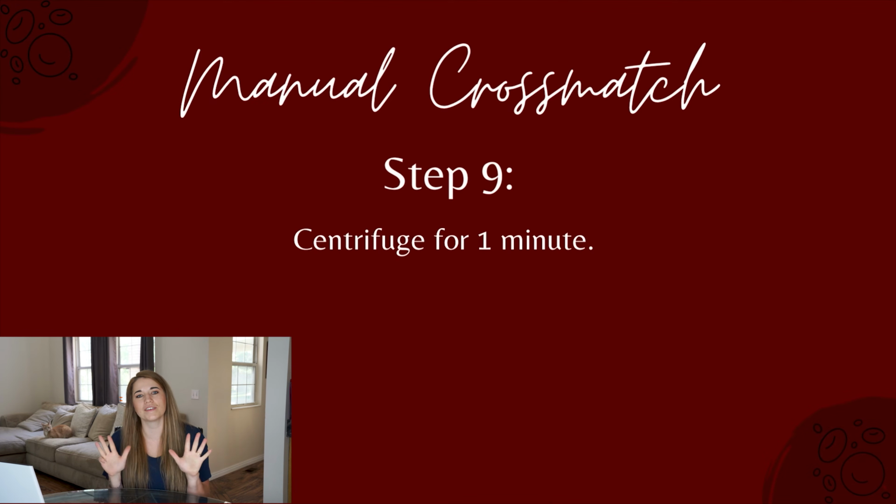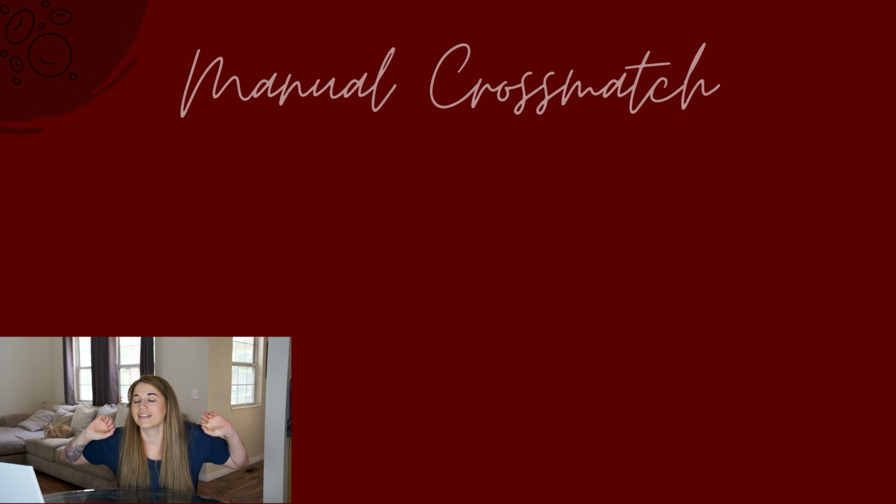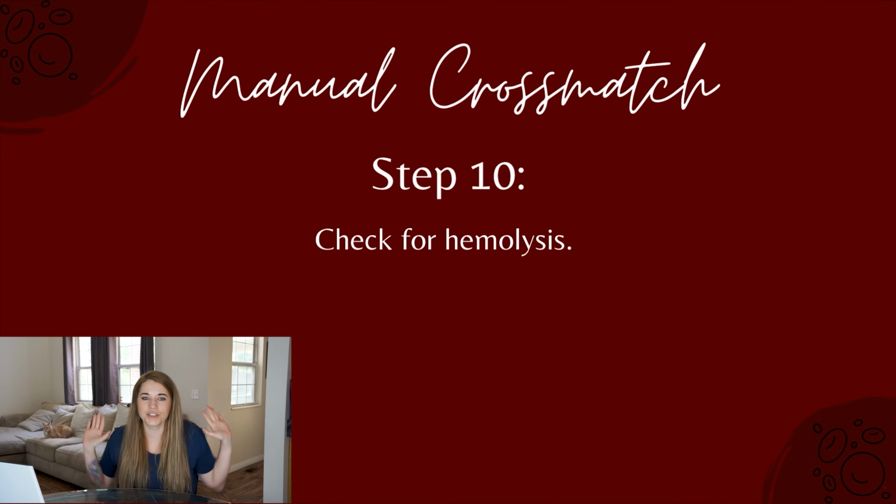Step 9, come back to your centrifuge one last time and centrifuge your tubes that have been incubating at room temperature for 1 minute. Step 10, take your tubes out, look at your control tube and look at your cross-match tube and evaluate for any hemolysis. There should not be any hemolysis in your control tube because it's your control tube. If there is, we've done something wrong and start over.